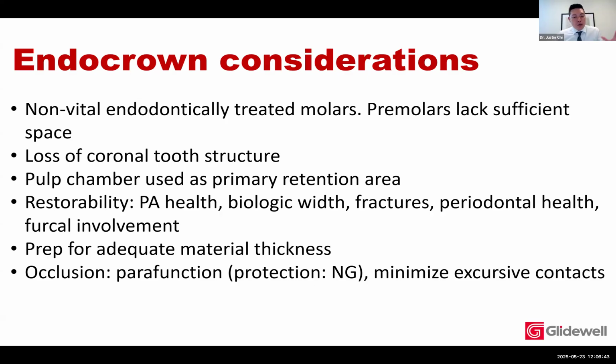Restoring teeth, natural teeth, implant restorations, all dental related restorations that we do are strong mostly in compressive forces, so downward forces down the long axis of the tooth. With these endo-treated teeth, depending on, of course, your bonding protocol, certain situations, well, these situations in general are unfavorable when there's a lot of excessive lateral forces. So I'll show you in the design how we can minimize these excursive contacts and where we would want to do that.